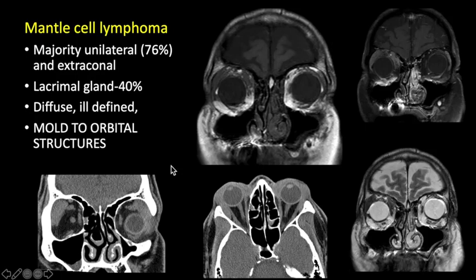Another case of lymphoma — this was mantle cell lymphoma. Majority of orbital lymphomas are unilateral but approximately 24% can be bilateral. Lacrimal glands are involved in approximately 40% of these cases. Lymphoma can be diffuse or ill-defined and molds to the orbital structures. Here we see bilateral smooth homogeneous enlargement of bilateral lacrimal glands and in another case asymmetrical enlargement of the right lacrimal gland with infiltrative soft tissue mass in the retrobulbar space — both are cases of lymphoma.